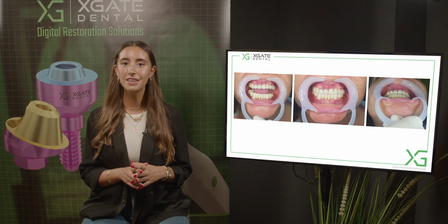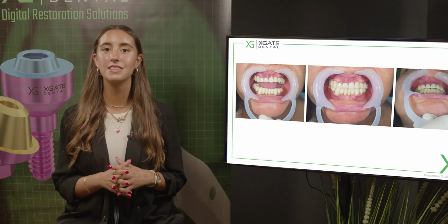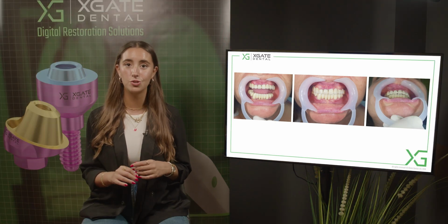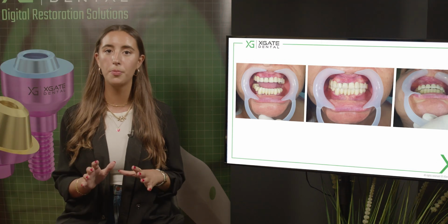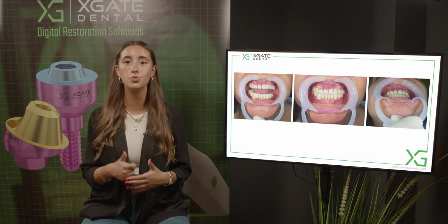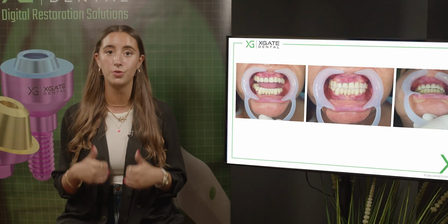You can see that the height of the canines is different and the height of the central incisors, and the second incisors are different in size. It's a PFM bridge, and the central line is not perfectly aligned. You have a lot of small problems, but the main reasons why we want to change the bridge and extract the teeth and do implants is not the aesthetics. It's the caries and the teeth under those bridges.